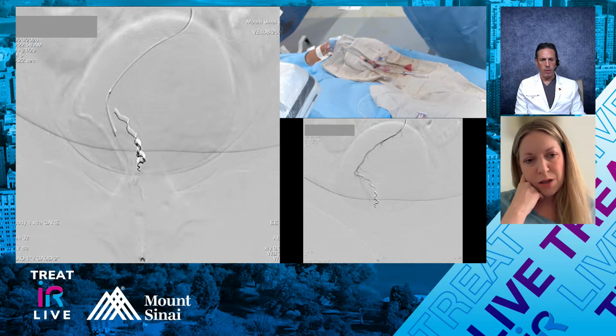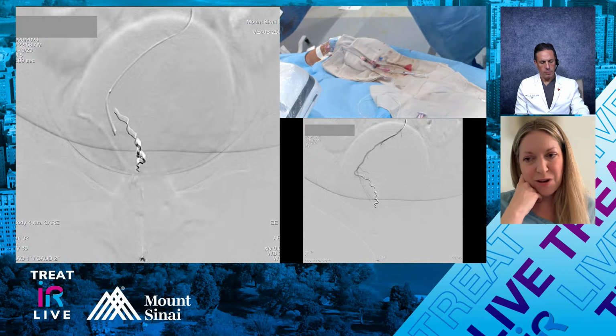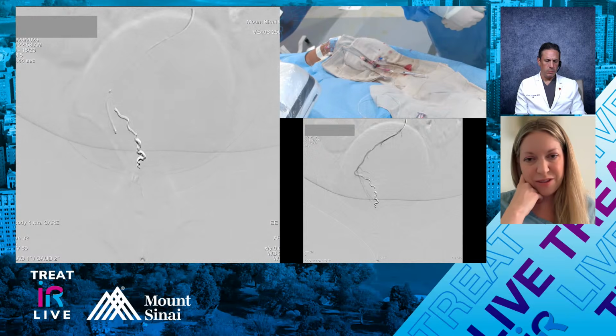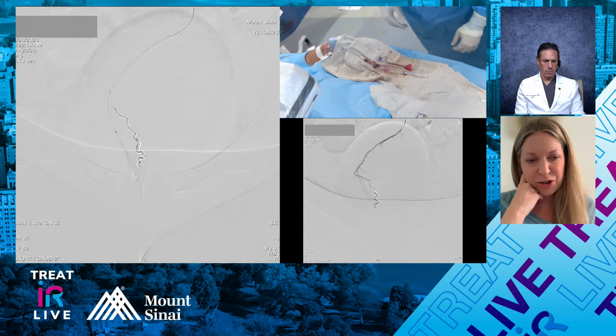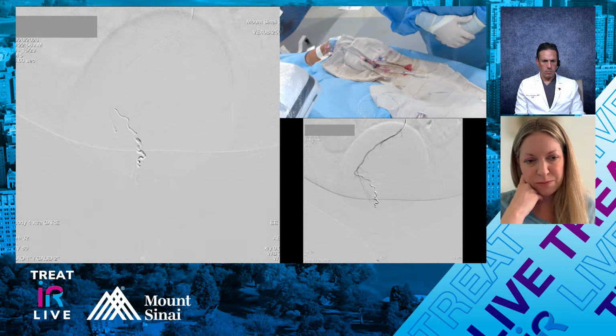What do you guys think? Yeah, I don't know. When you're getting that small, I mean, you could probably get away with it, but I'm not sure of the additional benefit it's providing at that level.